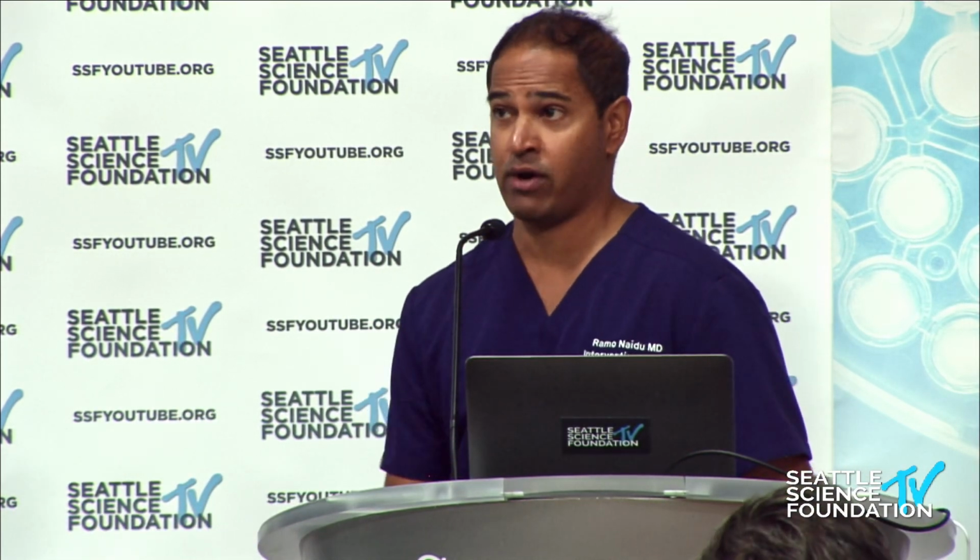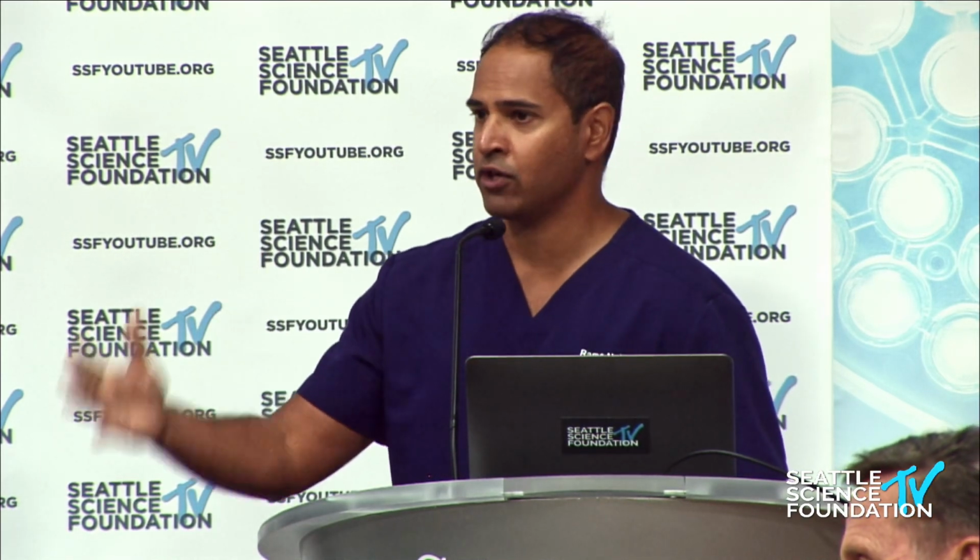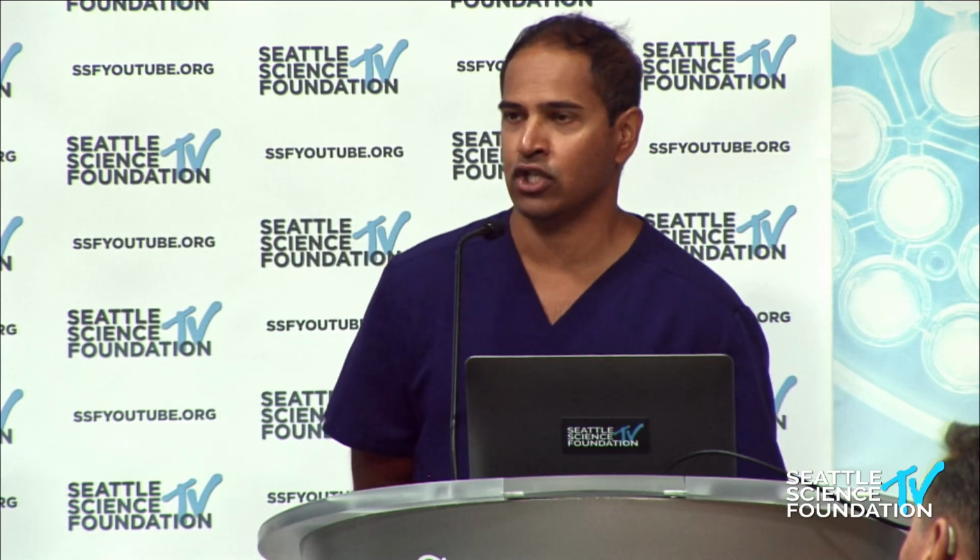That's where my pain is. That's where I want the wires. But if they ask me what do I think is best, what's going to give them the best chance of success, it's DRG. And then, of course, there's the coverage issues. So PNS is not covered by most commercial payers, whereas DRG generally is.